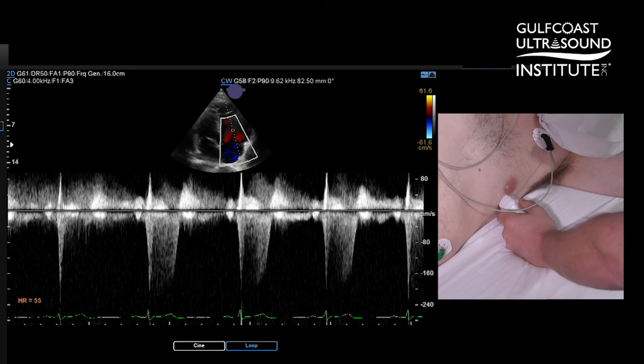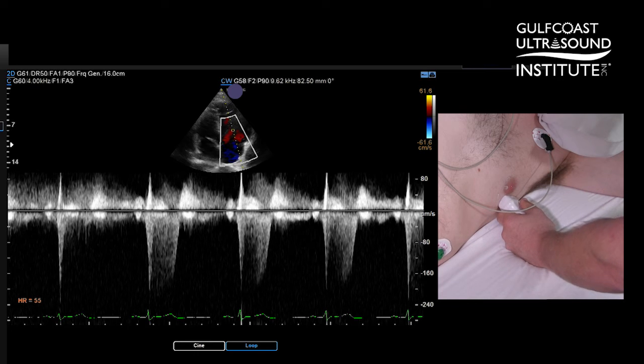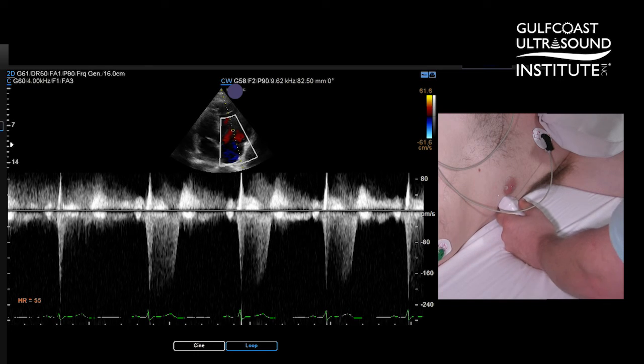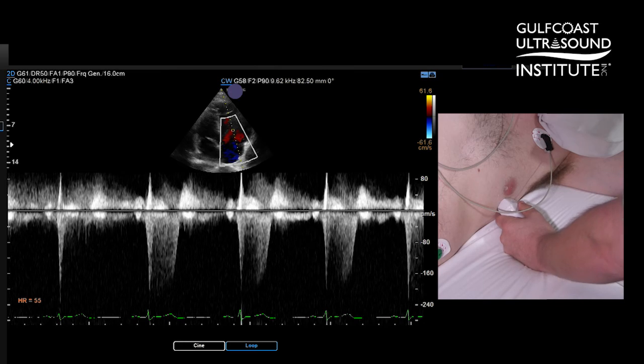Add this to your search for a tricuspid regurgitation jet in order to calculate your RVSP — right ventricular systolic pressure. That's your hot tip for the day. Now you give it a try.